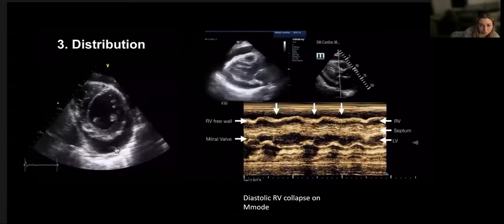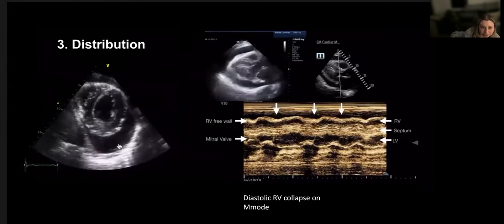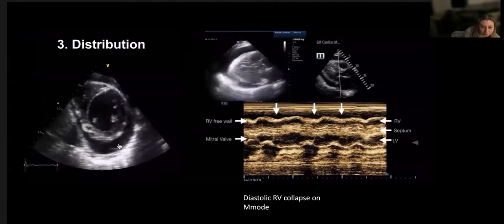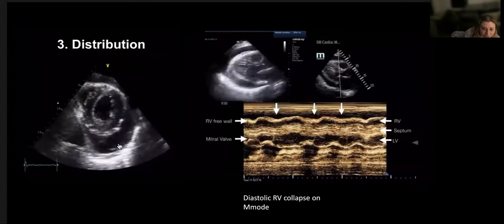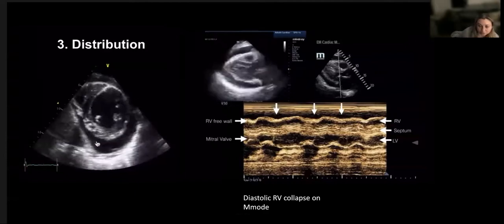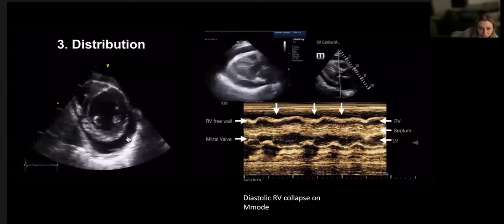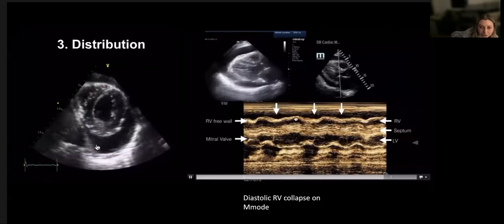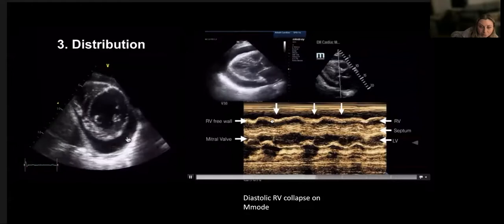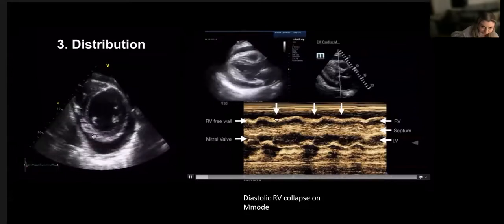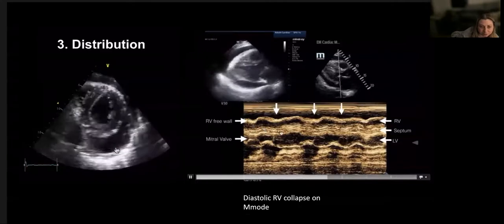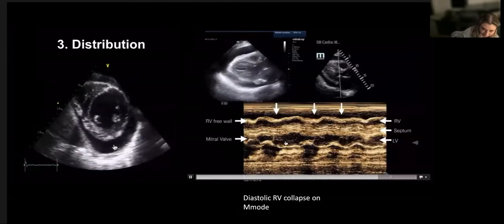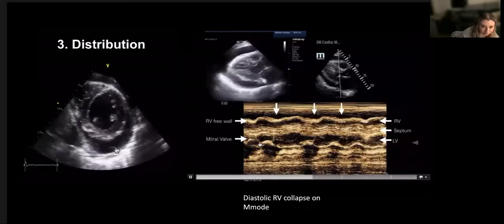This video shows M-mode and its use in assessing effusions. You can put M-mode across and see the effusion. It's also useful for identifying cycle phases. At the top is subcutaneous tissue, then the pericardial effusion as an anechoic area, then the RV free wall going up and down, then the septum, then the left ventricle cavity. The mitral valve creates an M shape with up-and-down motion in diastole - wherever we see this M shape, that's diastole.